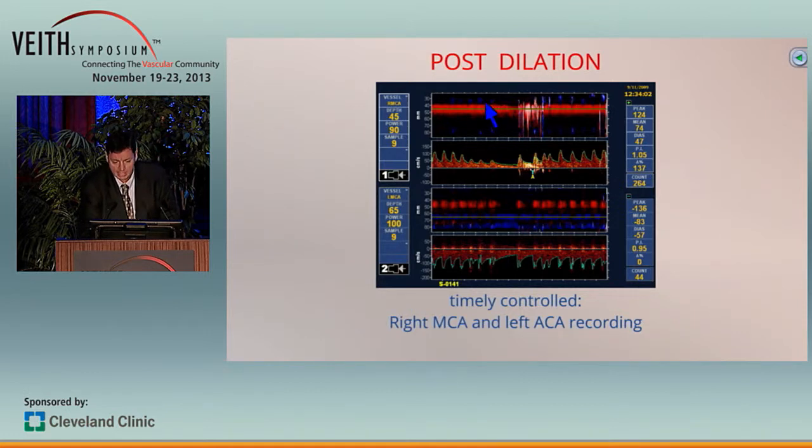The second part is, again, when we're doing the dilatation, we can see when we do not have flow, so you can quickly deflate your balloon and you don't wait too long when you run into asystole.